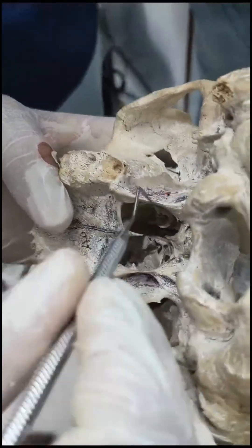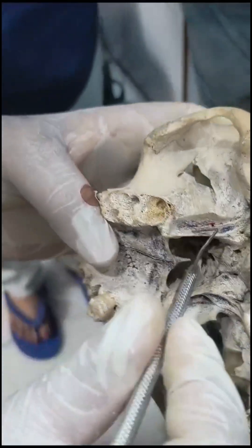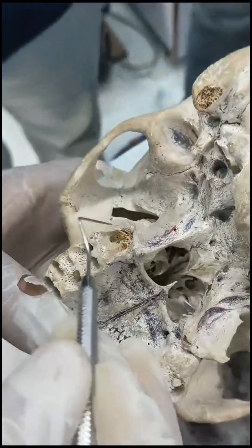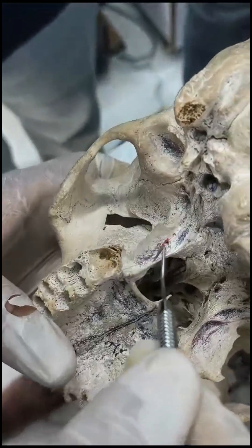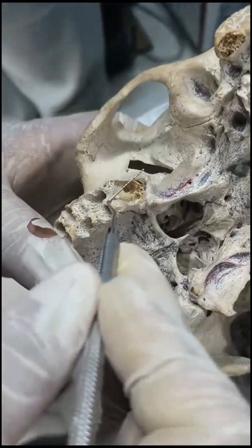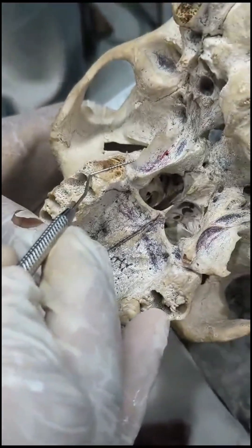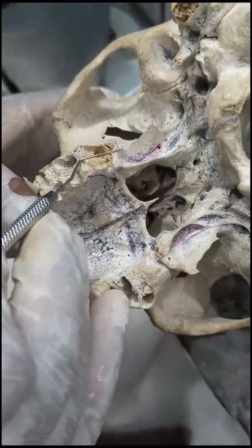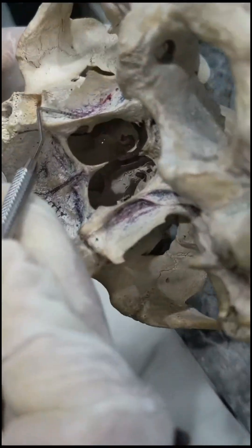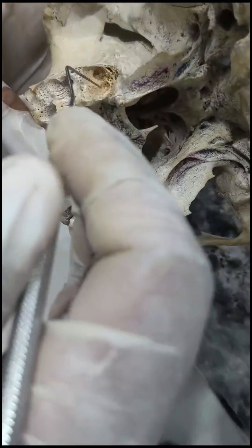Our target zone is this depression area between the two pterygoid plates, slightly angulated towards the medial side. To engage the implant into this site, I have to tilt my drill from this direction to this direction — and now we are perfectly falling within the realm of the pterygoid fossa.